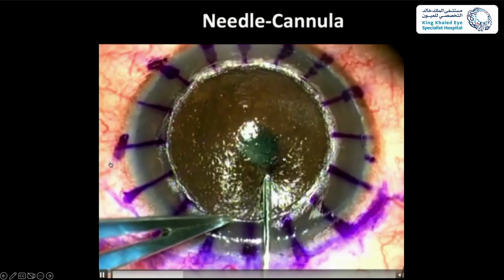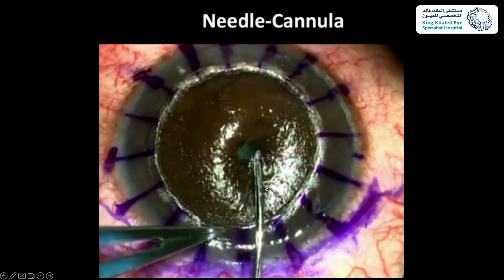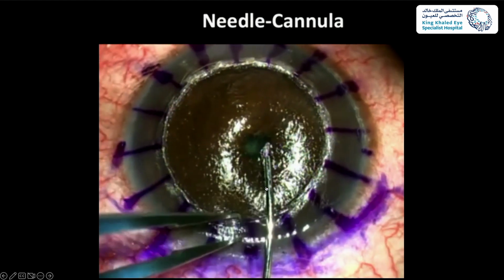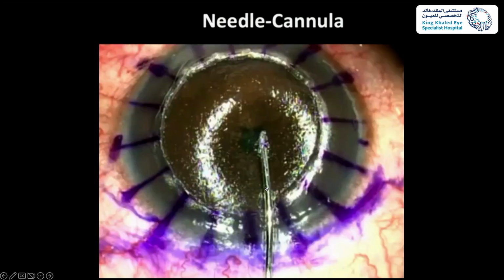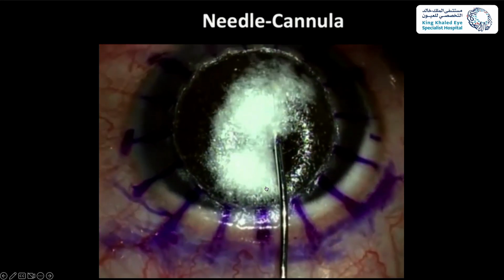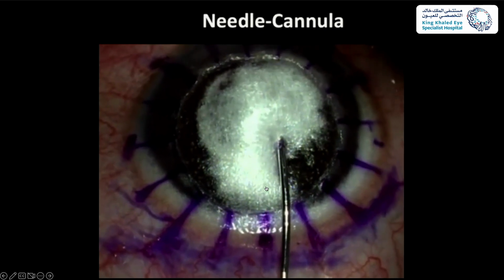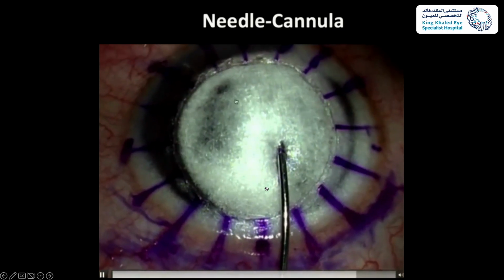So you see my mark here, and then I go with the cannula. Okay, then you get the big bubble, and then you continue as usual.